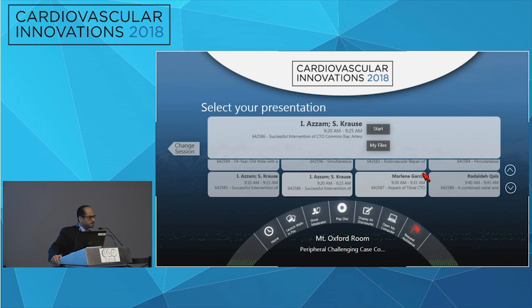But when you're dealing with that hypogastric, in that patient, that hypogastric was really important, right? The right iliac was occluded. Yep. That was really important. And sometimes that's the trick: you almost have to use some kind of hybrid. You want to use covered, and then when you get into a rupture situation, you're like, okay, now I'm stuck. I may have to sacrifice that hypogastric if I can't control the bleeding. So those are a lot of decisions you have to make.